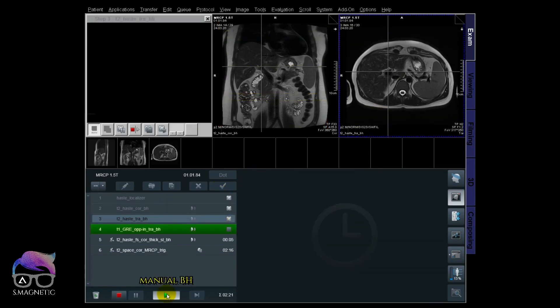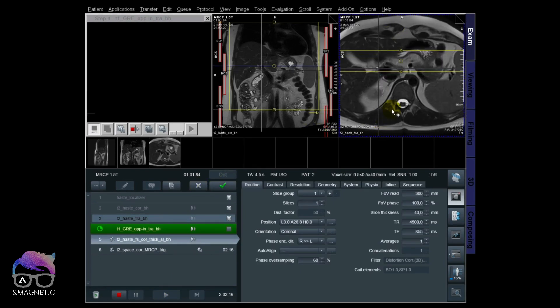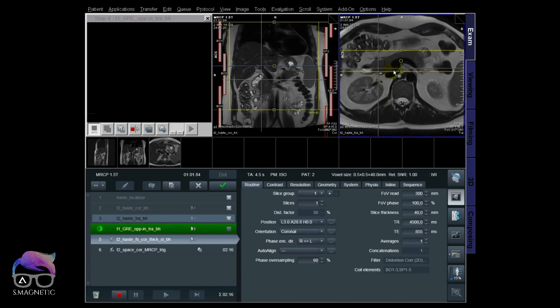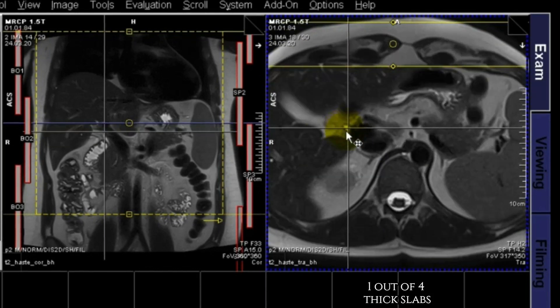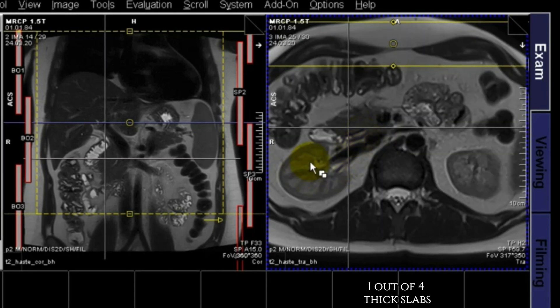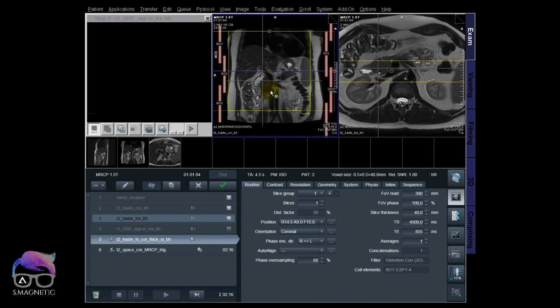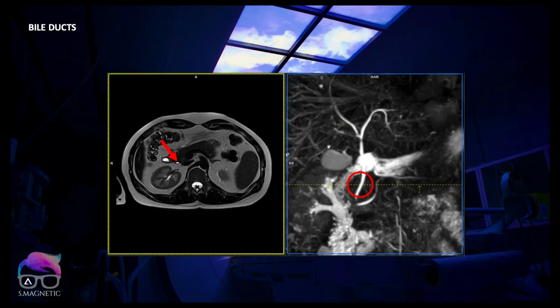That one is also a breath hold. Next we go for the thick slabs. Many sites do this as radial views, but I usually do thick slabs, and I'll explain why. I recommend doing these early in the protocol because you may need them soon. I'm scrolling on the HASTE sequence looking for the common bile duct, positioning the red column on it, and finding the isocenter in the coronal plane — the red arrow indicates the common bile duct, and that's the starting point of my first thick slab.